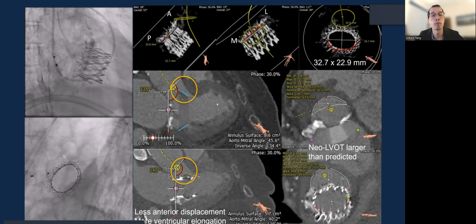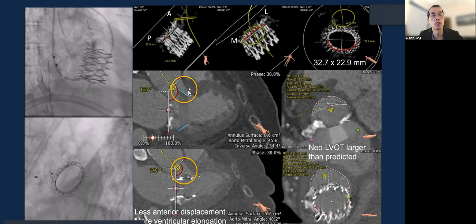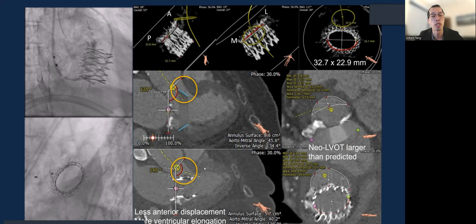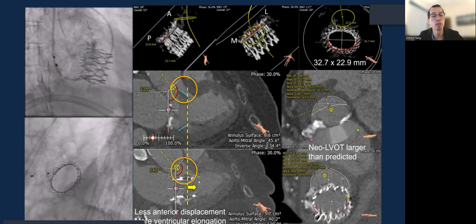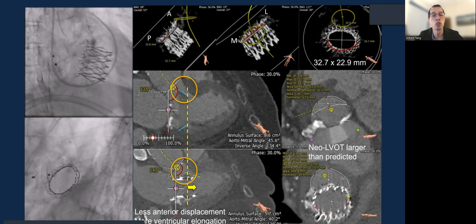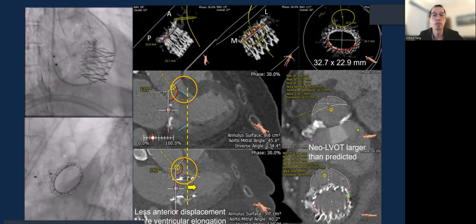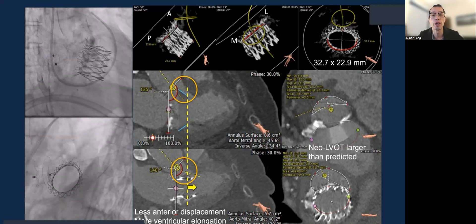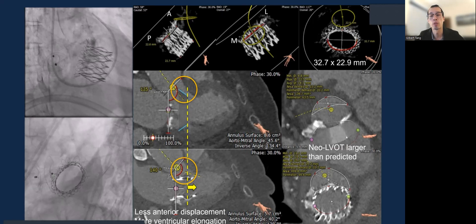The modeling prediction is quite different from the actual result. The top shows how we modeled the LVOT obstruction — the valve looks very close to the ventricular septum. However, the actual space is larger than anticipated because the valve is constrained in the AP dimension, yet the valve actually elongates more into the ventricular cavity. So even though the dashed yellow line cut plane does not suggest LVOT obstruction, obstruction may in fact happen further down into the ventricular cavity where the outflow of the device ends. The initial neo-LVOT was predicted to be around 140 mm², but actually turned out to be almost 500 mm² — much larger than expected.